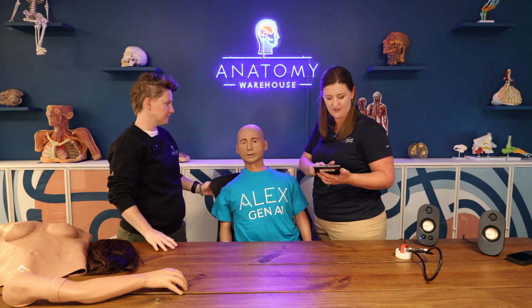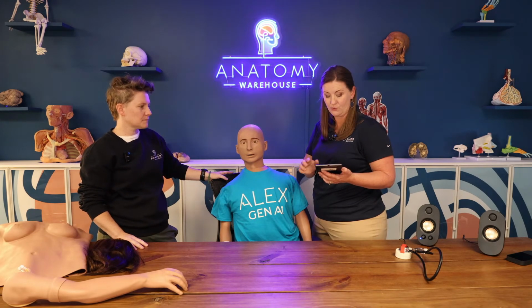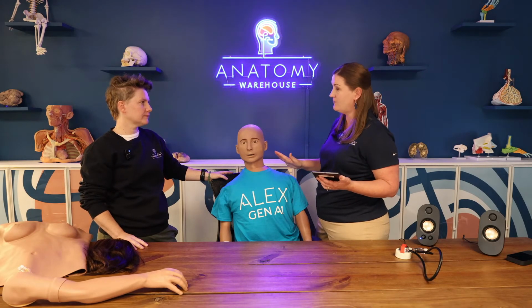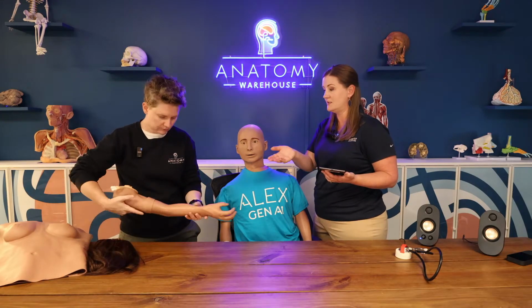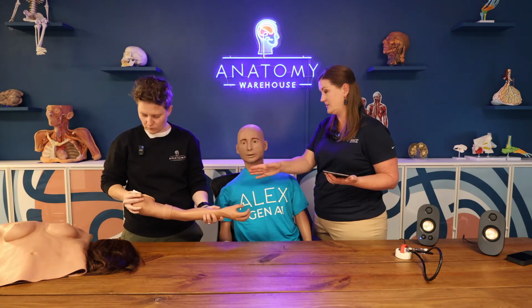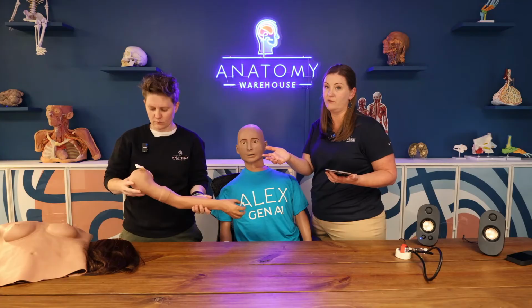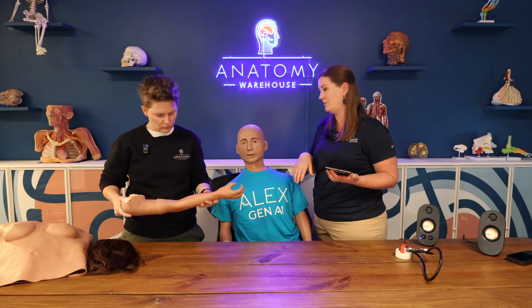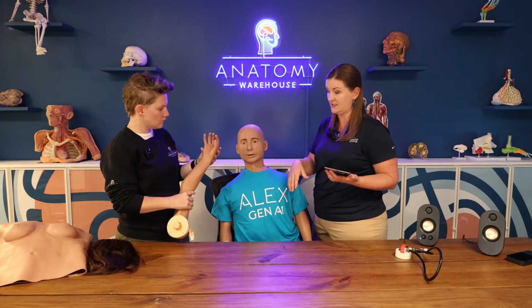Oops. Love the wig though. Yep, the female update kit is an additional purchase. So what comes out of the box is Alex in his very base form. The female update kit is a separate purchase, as is the IV arm. The other additional purchase with the mannequin is the ability to add an IV arm onto the mannequin as well. So you can see on the end there, it is a gravity-driven system. So very simple, one bag putting the fluid in, another bag catching the fluid coming through. The skins and the veins can be replaced, so the school doesn't have to send it back for any kind of repair.